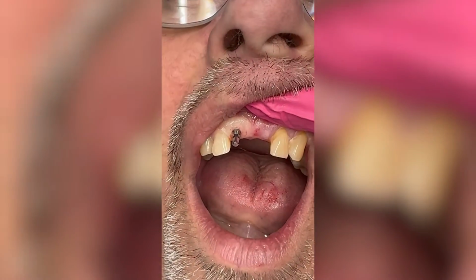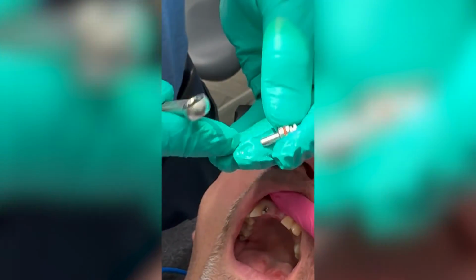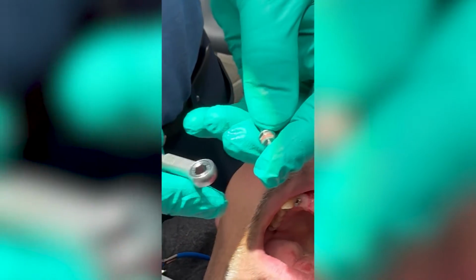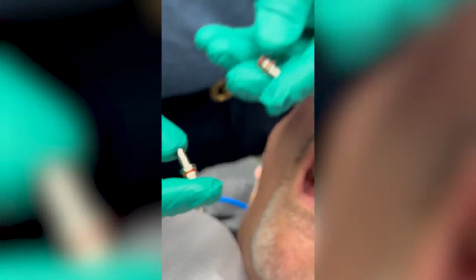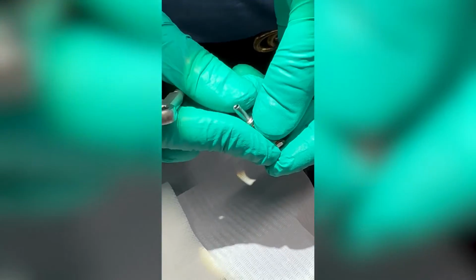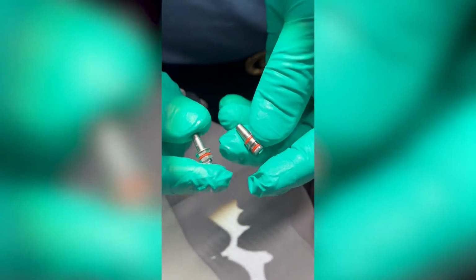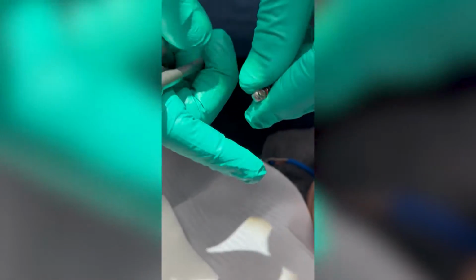Okay, so I'm going to take the ratchet driver. And now we're going to use this instrument, which is our ratchet driver long for the mono. It looks very similar to the disposable carrier that comes with the implant. Don't get confused and throw away the wrong one. This is disposable, it comes with each implant. This one stays in your kit. This has 1 ring, the disposable one has 2.